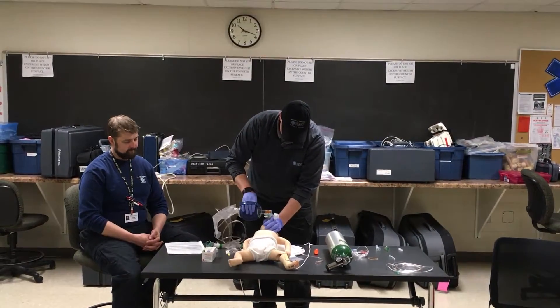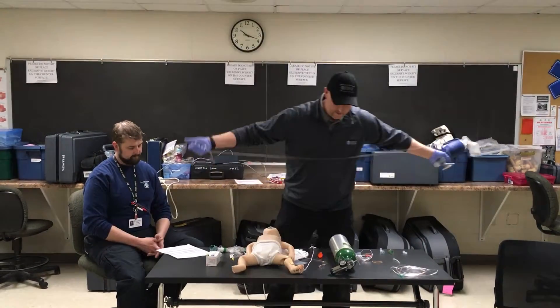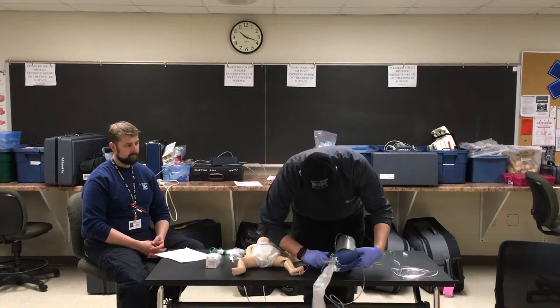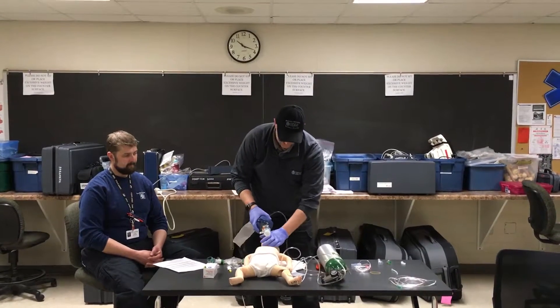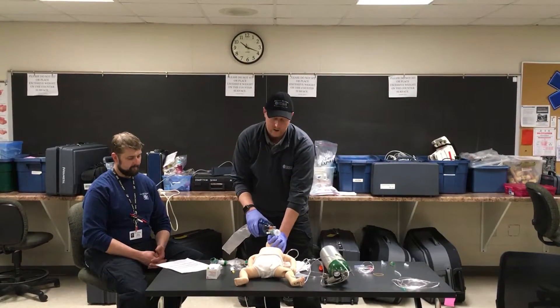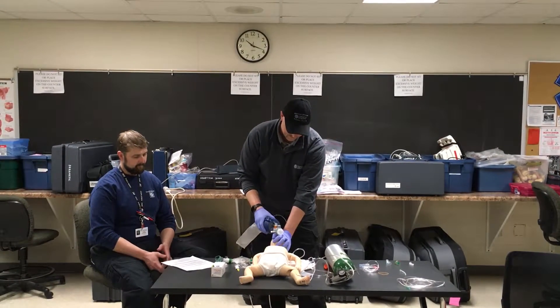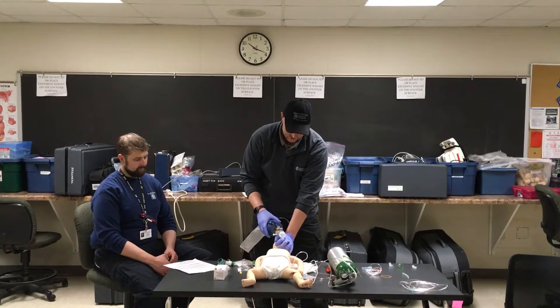Get a good seal. I can see chest rise. Because our airway is in, we're going to hook up our oxygen and turn it up to 15 liters per minute, and we're going to continue ventilations. Ventilations should continue at one breath every three to five seconds, and we're going to do this for one minute, watching for good chest rise.